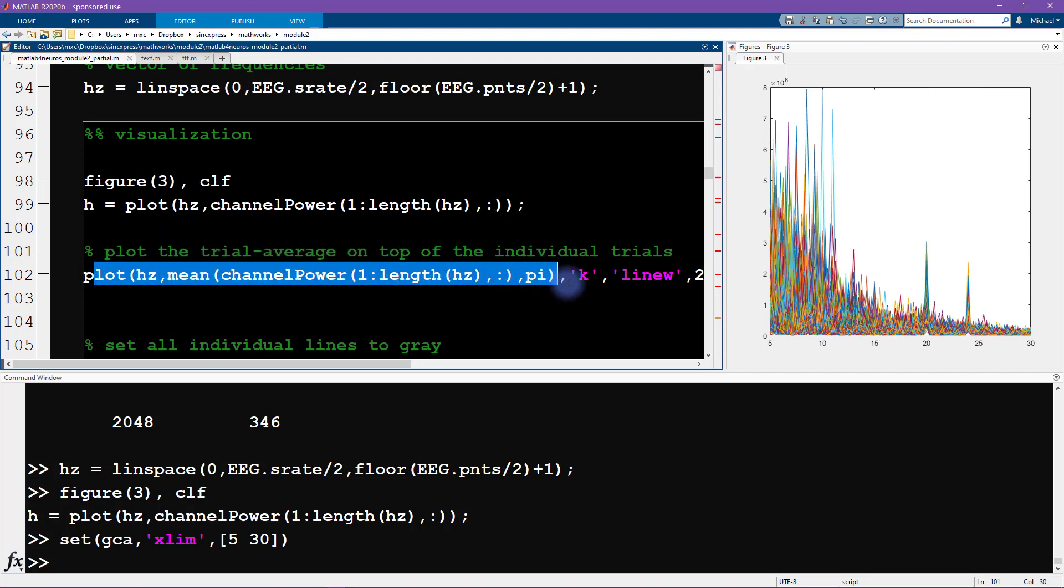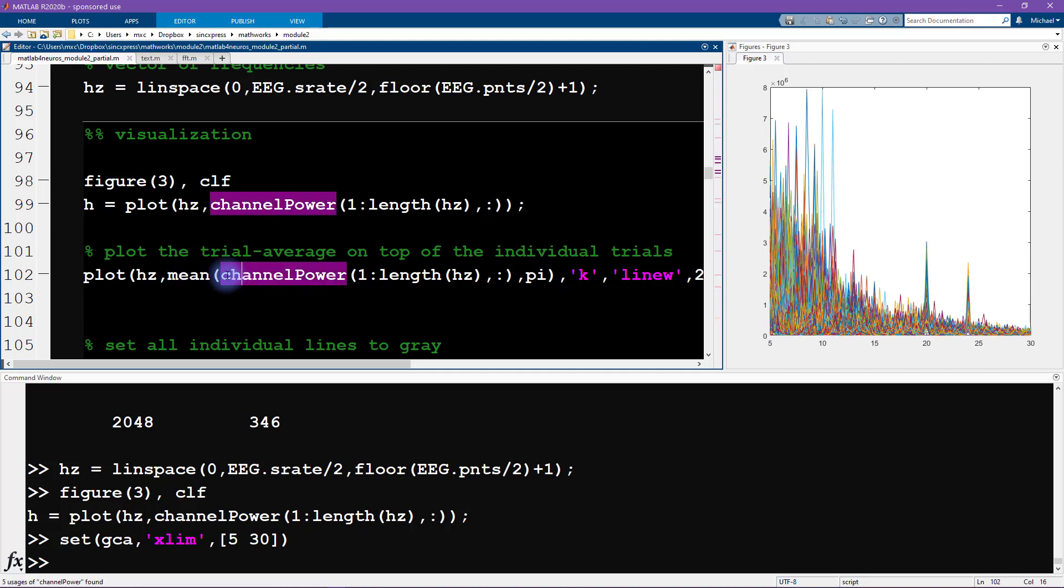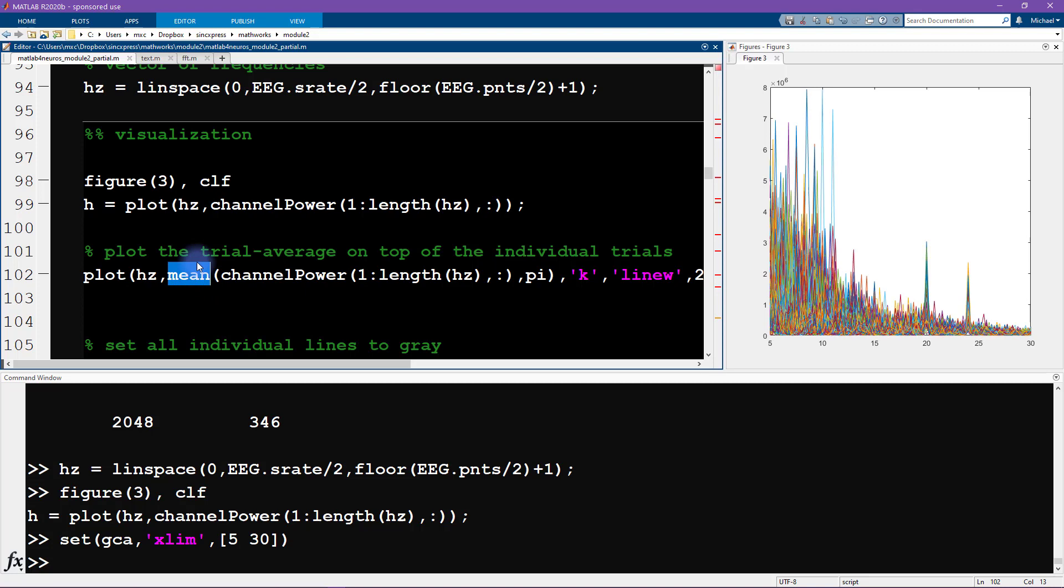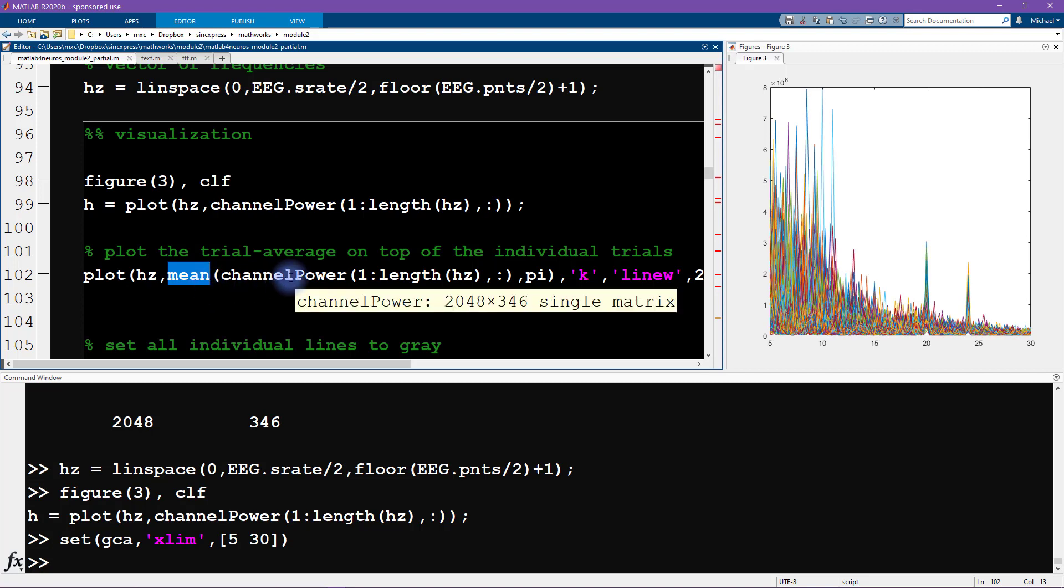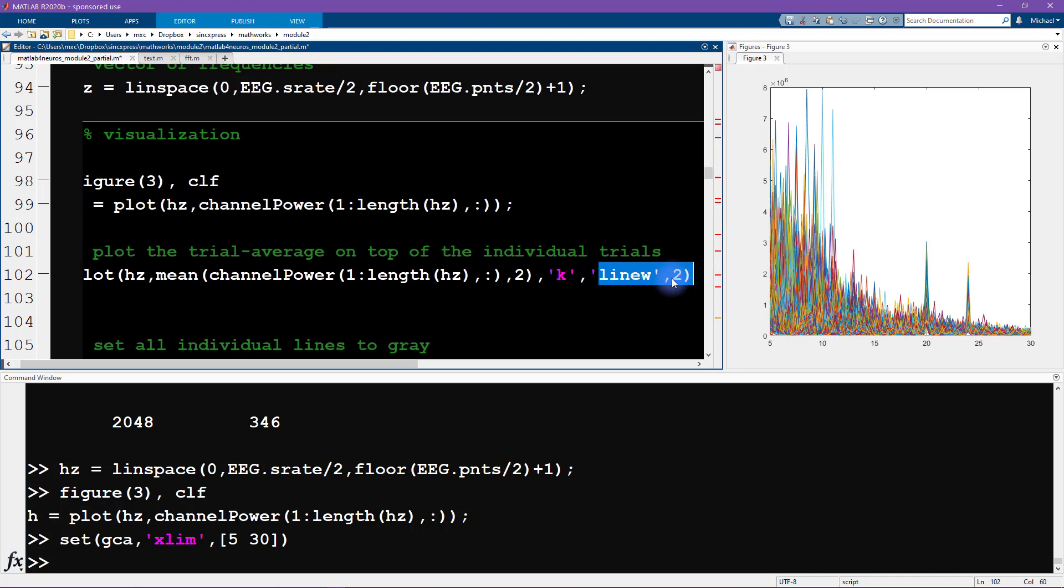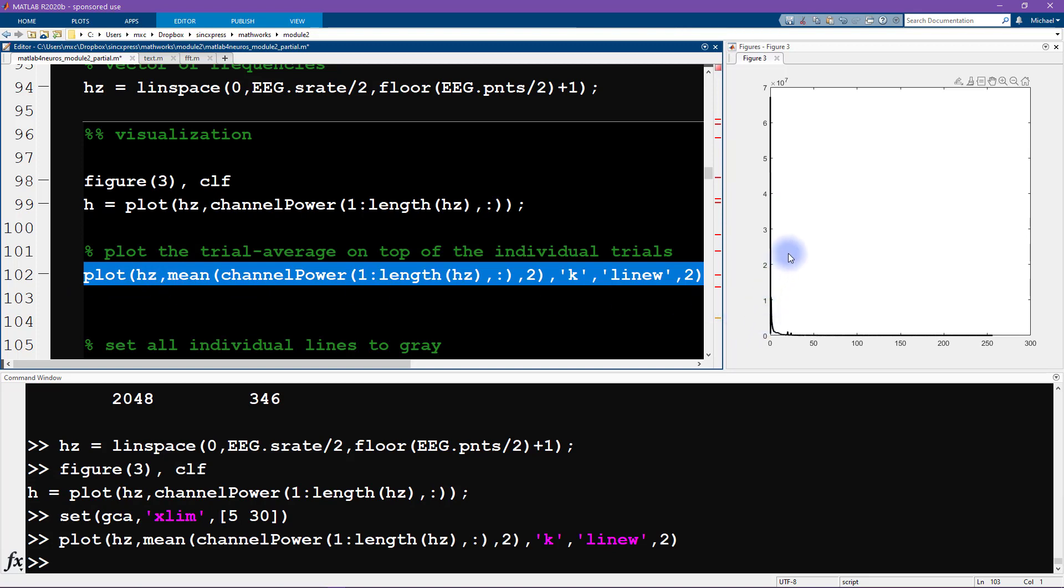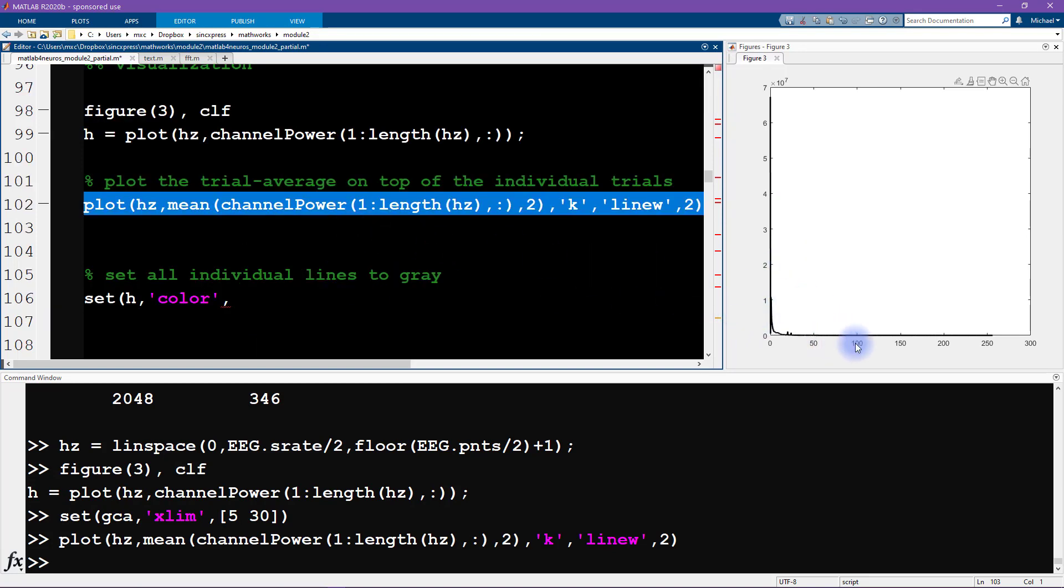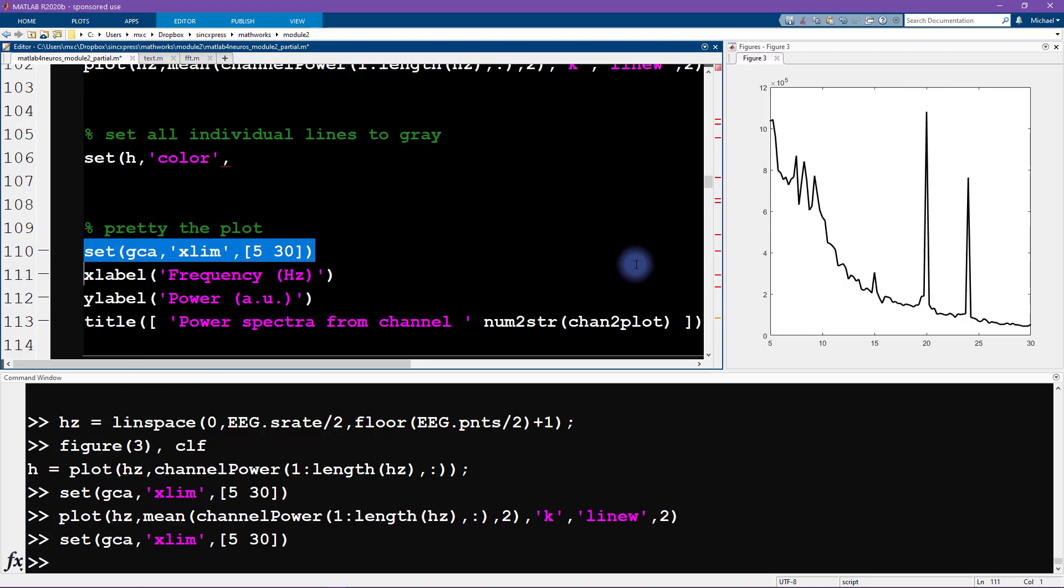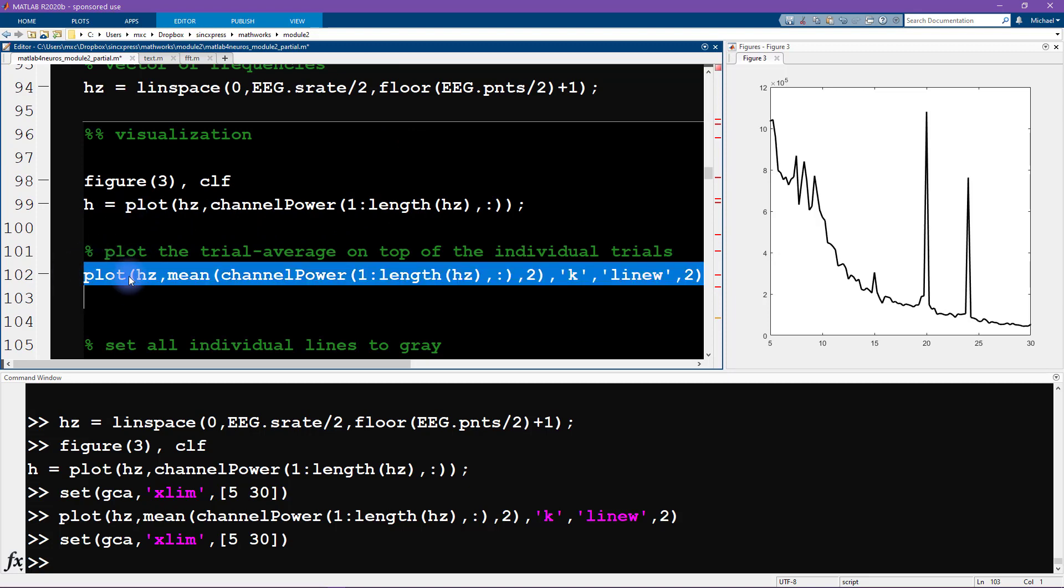First, we are going to plot the trial average on top. This line of code looks really similar, except we have a mean function here. We're taking the power spectrum over all the trials and then we are averaging. The second input into the mean function is the dimension that we want to average over. We want to average over trials, not over frequencies. So therefore, we want to average over the second dimension. This specifies a black line with a line width of two. But you can see that the x axis limit went back to what it was before. What happened is that every time you run a new plot function, MATLAB is going to clear all of the previous information that was already plotted.